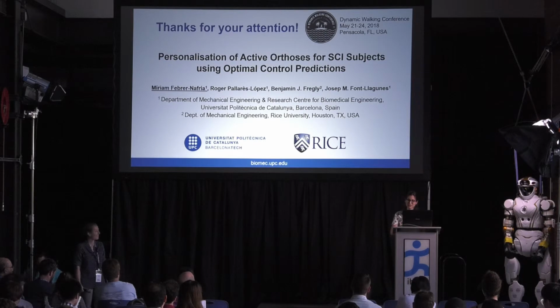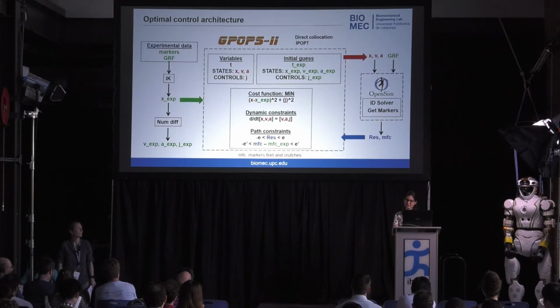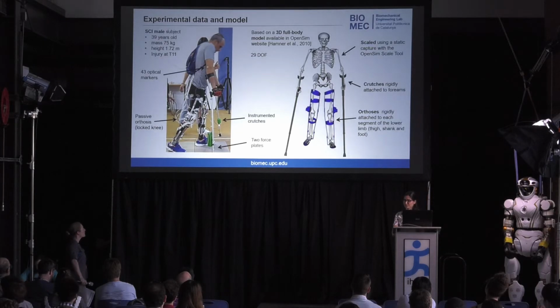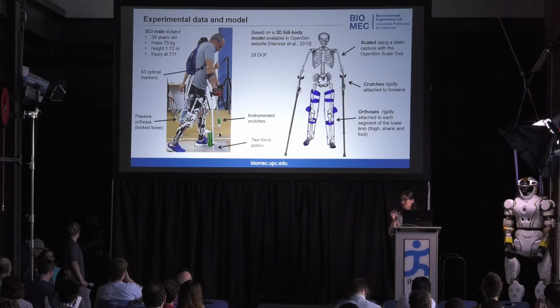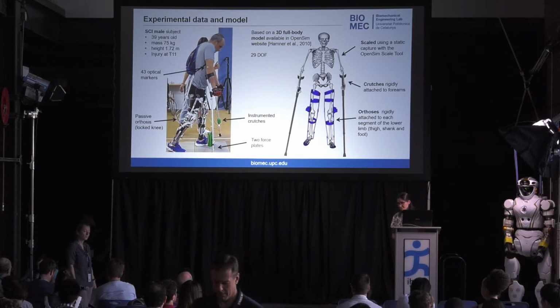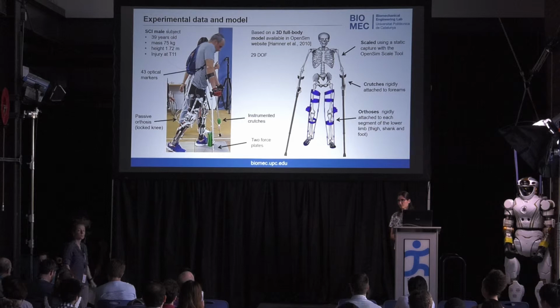Okay, so the OpenSim model, we are using it at the skeletal level. I mean, we solve the inverse kinematics and dynamics, but we stay at the torque level of each joint. So you're using it as a model of basically transmitting the torque and power source from your exoskeleton through the skeletal model to the world. Is that true?